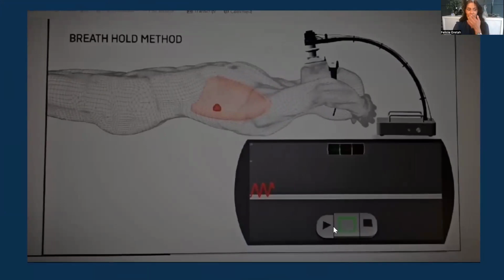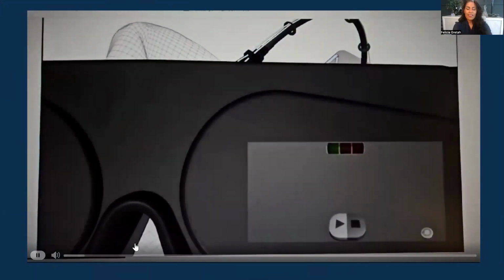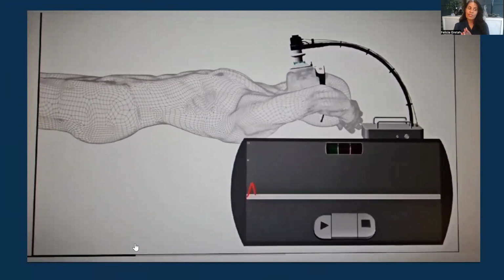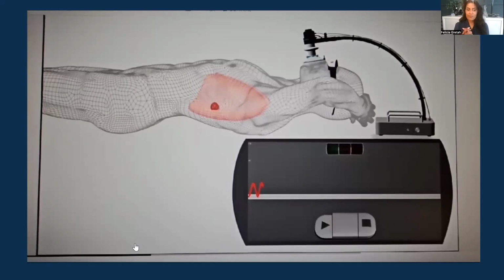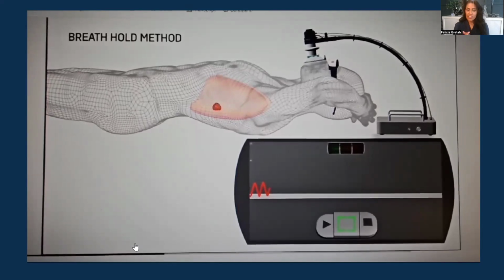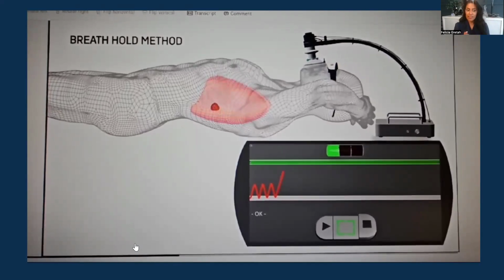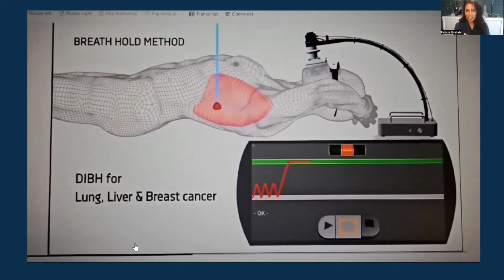Through the video glasses, the patient can see this gray screen in the bottom corner. They're able to see their breath as it rises and falls. The visual of the body is a really nice representation of how a tumor can move during normal breathing. You'll see that supine motion as the patient breathes. Once the patient achieves three stable breaths in this bottom right corner, a green bar will appear that shows the patient their target depth to breathe into. As they hold, we can see that the tumor stops moving and the treatment can be delivered very accurately.